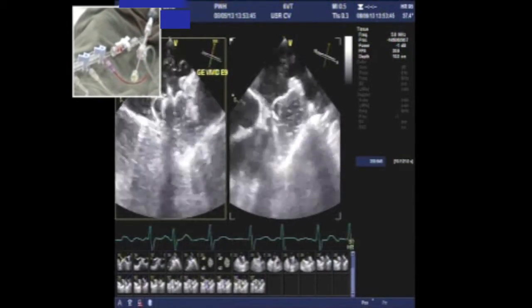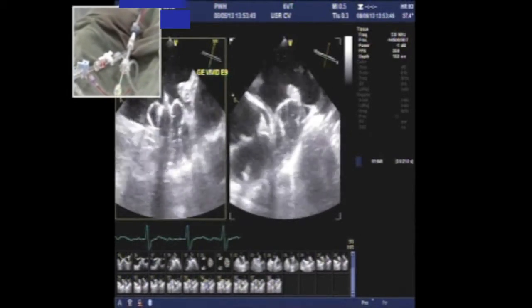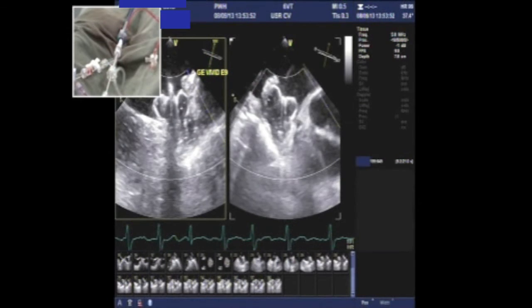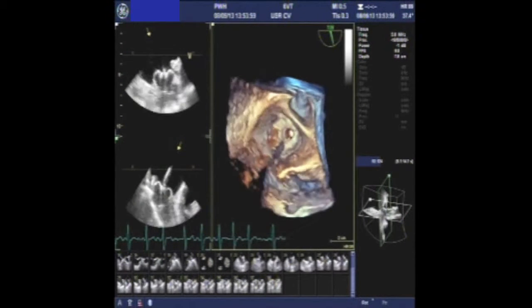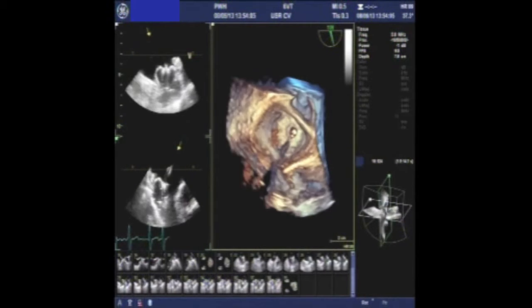It's definitely better covered. But it's not okay. The shoulder is too big. The problem is the stability. It's not compressed enough. Is there a larger device? Yes, we have 33, right? We have 34. 33. Yeah. Okay. So we need a larger device here.